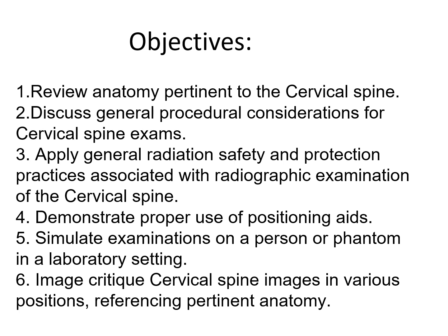Okay. General radiation safety and protection practices: you should be able to shield. We'll also talk about the radiosensitivity of the thyroid gland. I think we mentioned this with the clavicle. Same consideration. Your thyroid gland is on the anterior of your neck. It is a radiosensitive organ. If the person wishes to protect their thyroid gland because they have thyroid disease and they've been given instruction by a surgeon, you can do their projections PA rather than AP and reduce their overall dose to their thyroid gland because of the attenuation of the beam through the body.